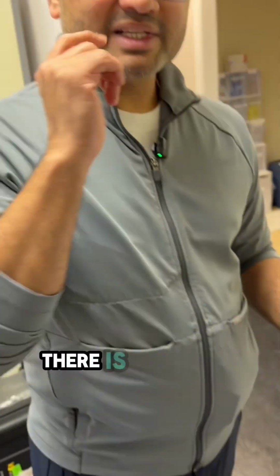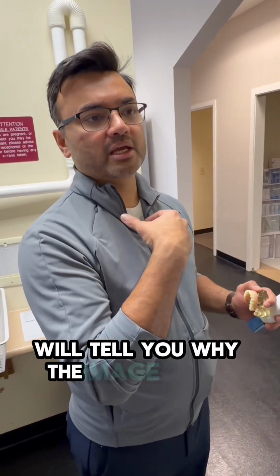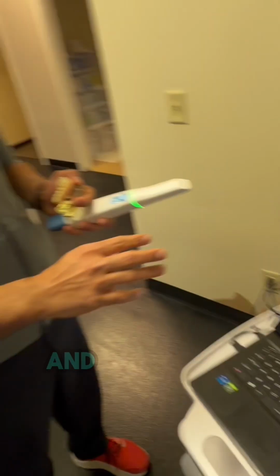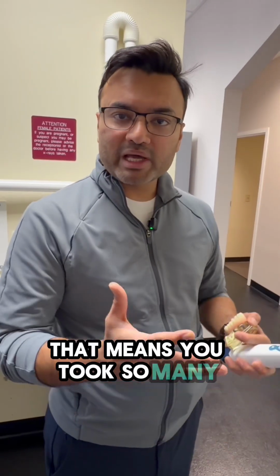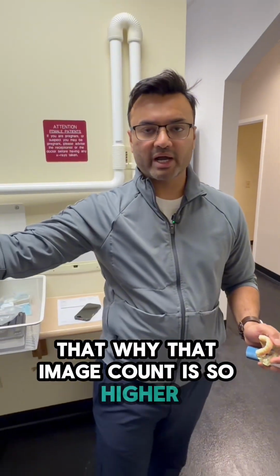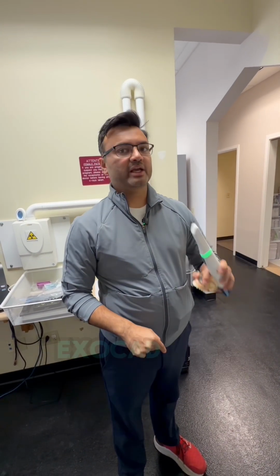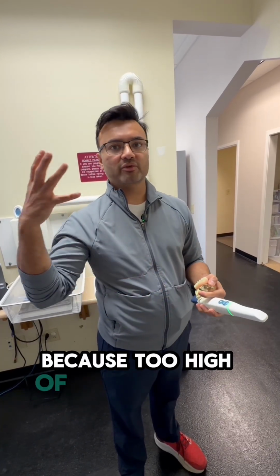There is a reason why the reps or the companies will tell you why the image count matters. Image count matters, meaning if you took a full arch scan and your image count is over 5,000, that means you took so many pictures. It's just one picture piling on top of the other. As soon as you send that data to the lab, they're going to run that on ExoCAD. ExoCAD will immediately have problems stitching images together because of too high an image count.